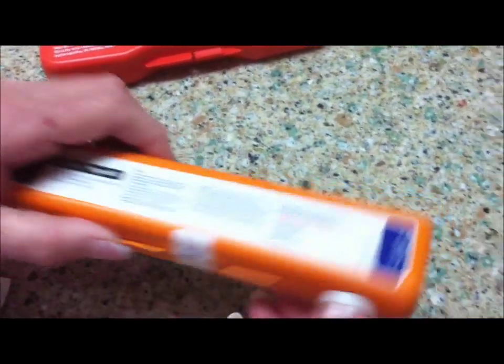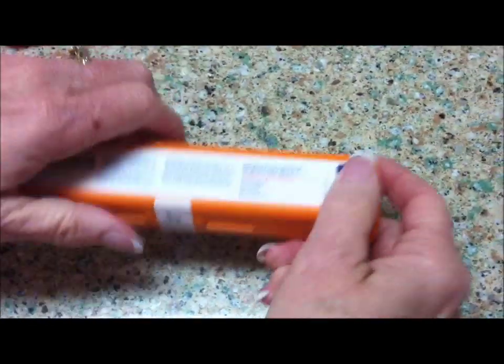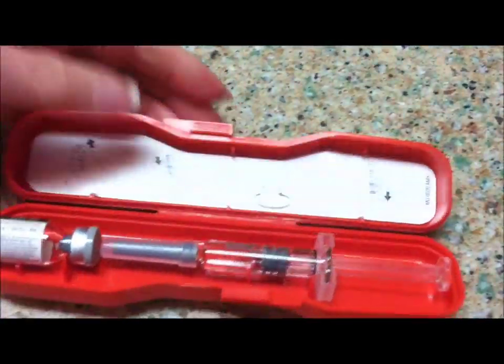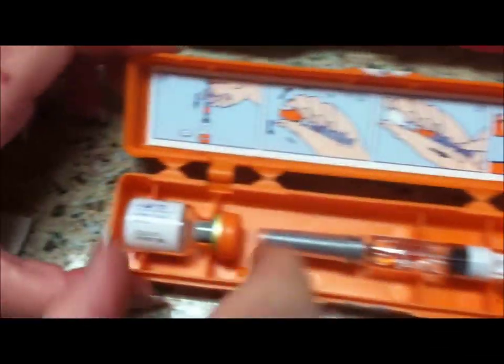I'm going to use the glucagon hypo kit only because it's already outdated, and I possibly could not use this for someone in the future. When you open up both cases, there are instructions in the middle. It already comes with a lyophilized powder in a vial.